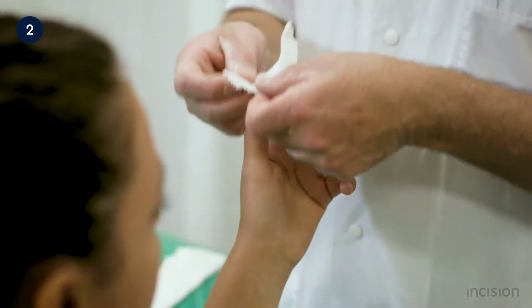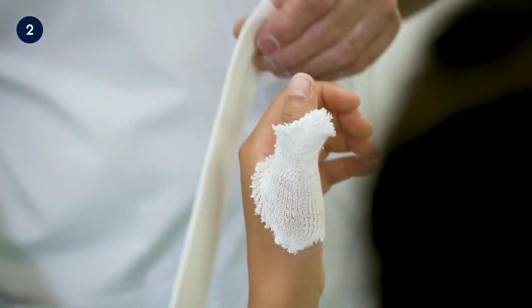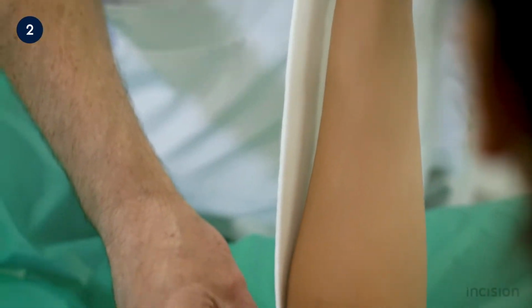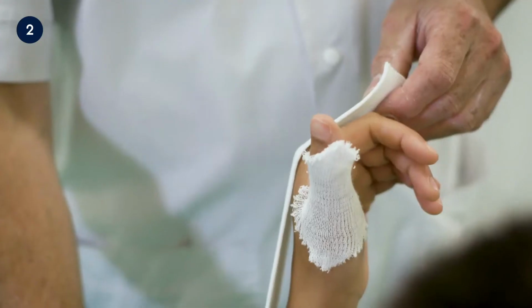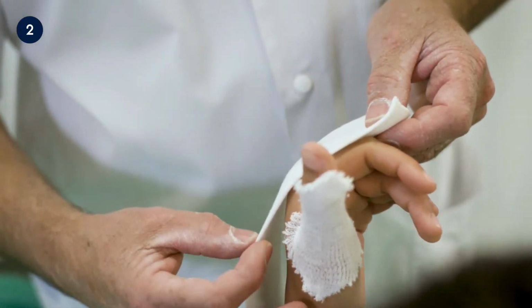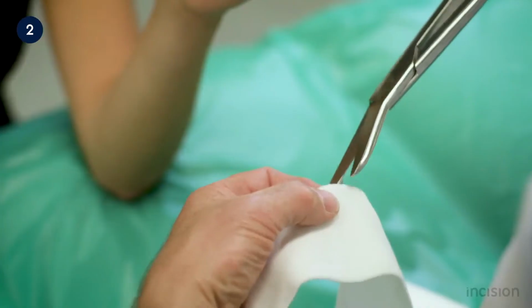The small stockinette is placed over the thumb. The length of the stockinette to be applied over the forearm is now measured. The stockinette should be long enough to cover the entire forearm and include the hand. A hole should be created through which the thumb is placed. The location is decided using the patient's base of the thumb as a landmark, and a small hole is cut.